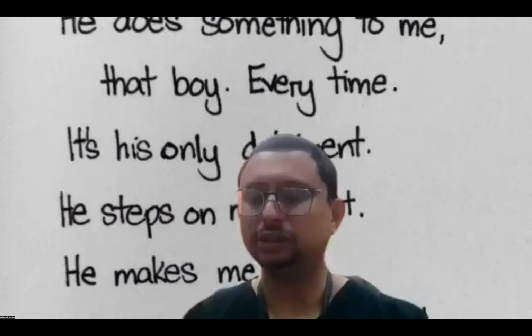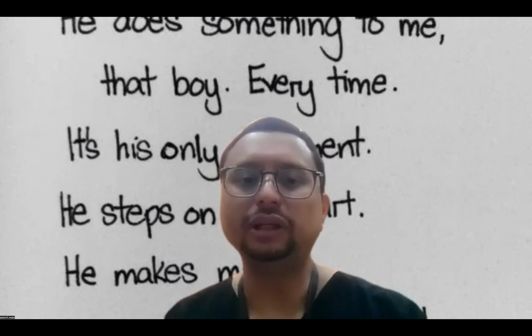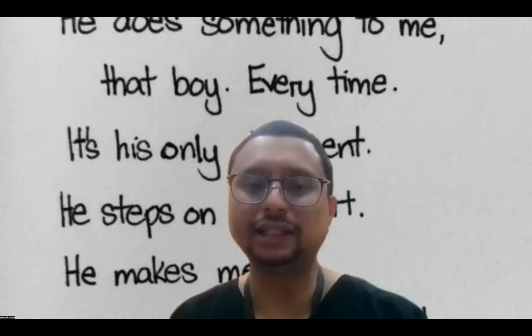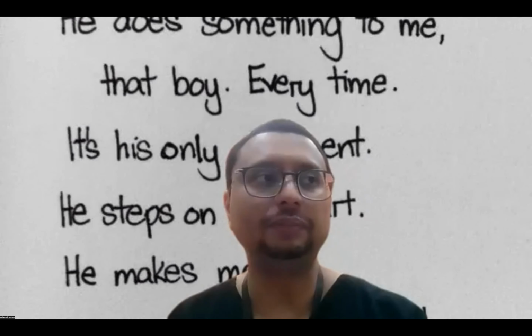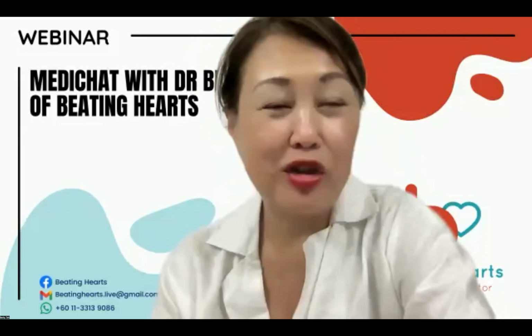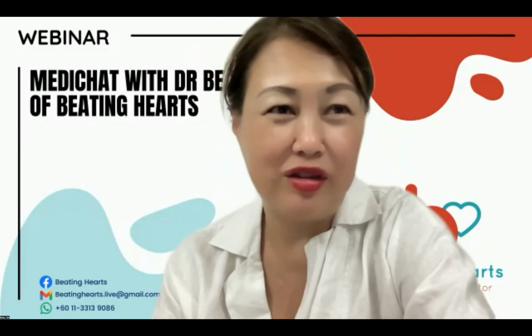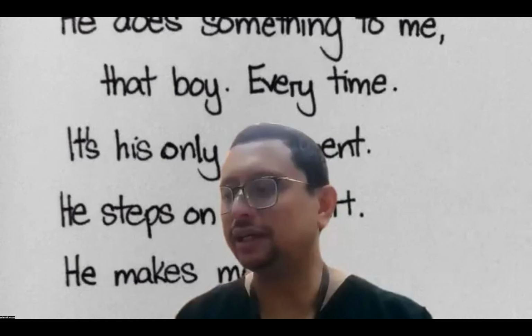What do you think? Yeah, I think so too. If you do stress echocardiogram, I think it's very useful. I like to do stress echocardiogram. Very accurate if it's read by a very expert person. Yes. So if the stress echo is read by me, it is 100% accurate. Yeah, I hardly do at all, because you really need an eye to see the hypokinetic region, and it's quite difficult for me. Yeah, it is difficult.